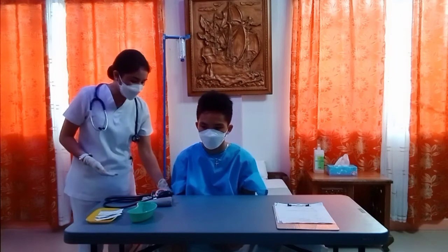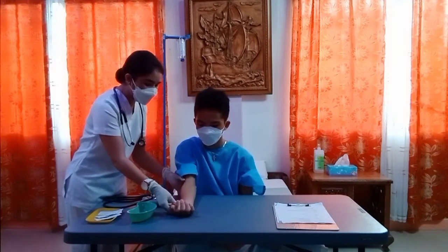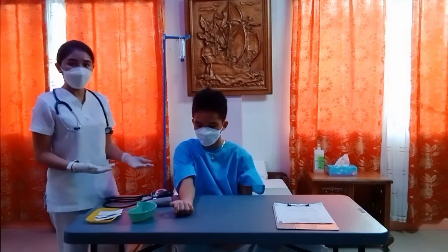Okay, sir. Thank you. Improper leg positioning may alter the perception of the blood pressure reading since it can elevate the systolic and diastolic blood pressure. Next is to slightly flex the elbow of the client with the arms facing upward and the forearm supported at heart level.